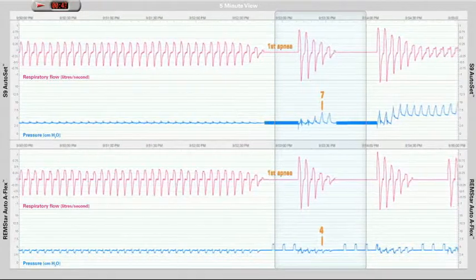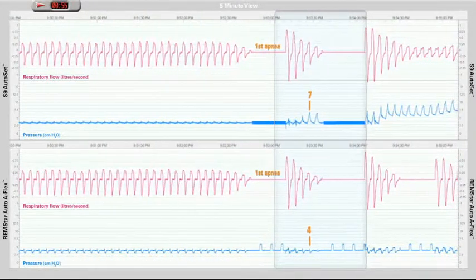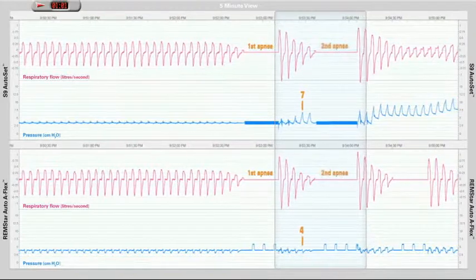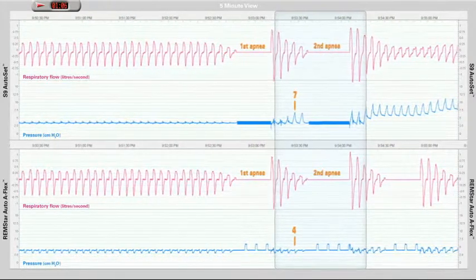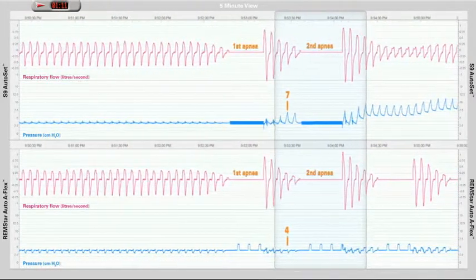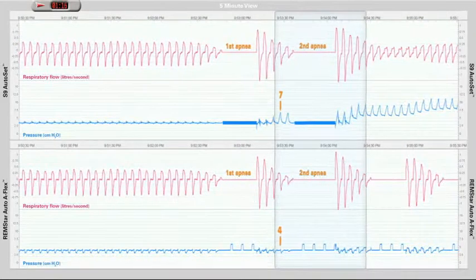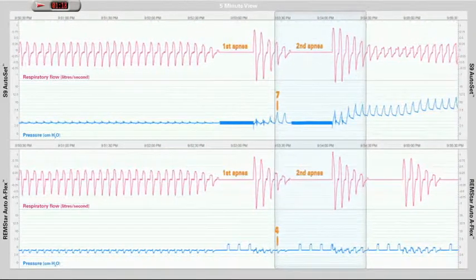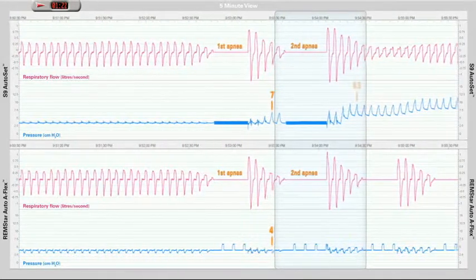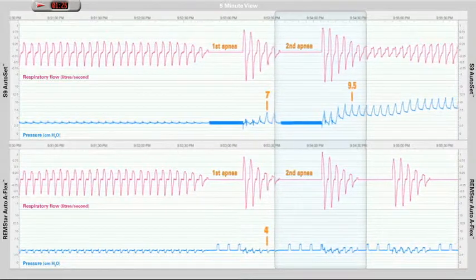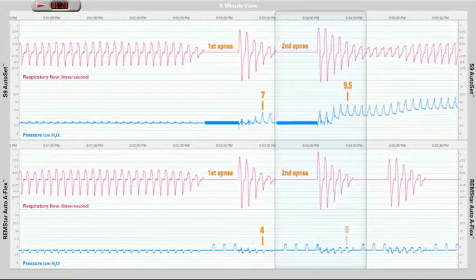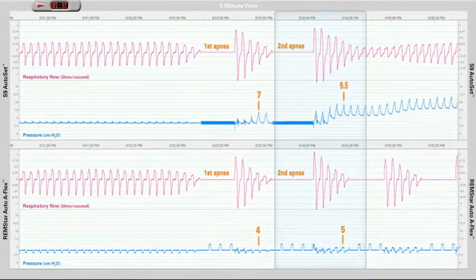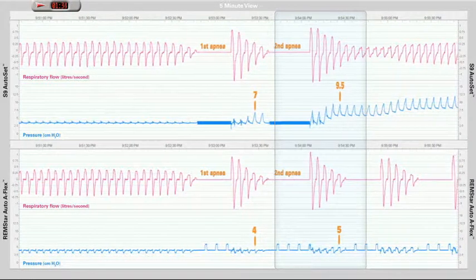Both patients have a second obstructive event. The S9 Autoset detects that the second apnea is obstructive and responds by increasing the treatment pressure to approximately 9.5 cm. The Remstar Auto increases the pressure by only 1 cm to 5 cm in response to the second apnea.